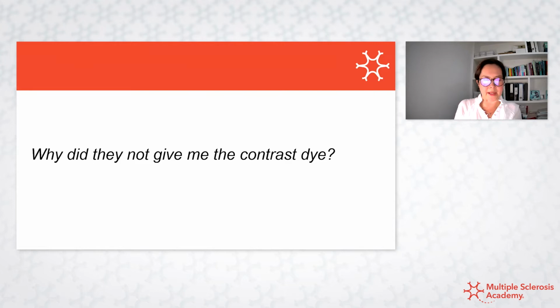So there's been evidence to show that gadolinium accumulates in the brain, in particular areas of the brain, in the basal ganglia and the dentate nuclei. So there's good evidence that the accumulation occurs, so you get this deposition, but there's no evidence of harm. And what's been shown is that the deposition occurs less with macrocyclic gadolinium, a particular type which has a circular formation rather than a linear gadolinium.